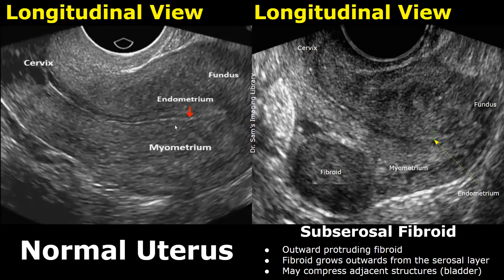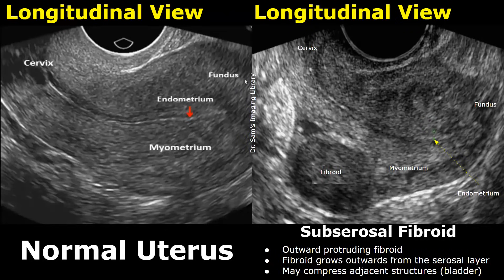These are transvaginal images of the uterus. In the normal uterus we can see a thin endometrial stripe. This thick muscular layer is the myometrium. The upper portion is the fundus and the lower portion of the uterus is the cervix.